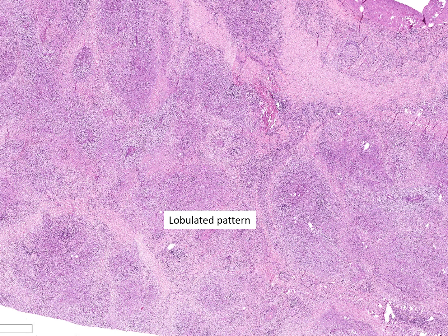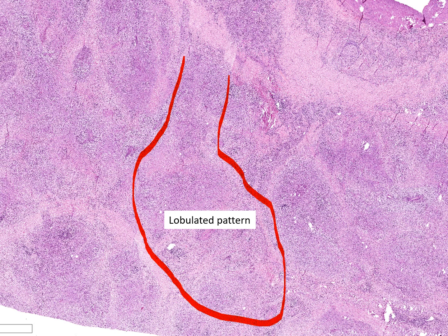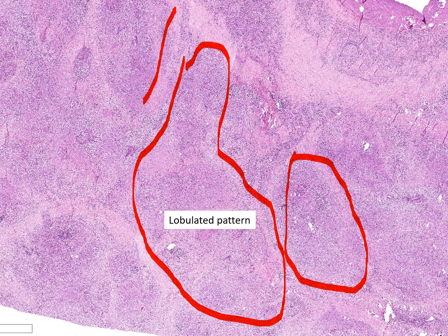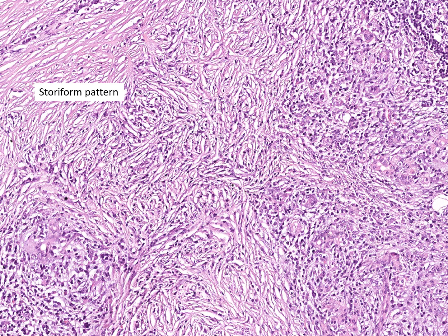This is a very low power image of the pancreas, and the thing that strikes me the most with these cases of type 1 autoimmune pancreatitis is this lobulated pattern of growth. Note these lobules here, here's another lobule, and these lobules almost fit together in a jigsaw pattern-like appearance. This is very different from pancreatic adenocarcinoma, which is a very close clinical mimic. Pancreatic adenocarcinomas almost never show this lobulated pattern of growth.